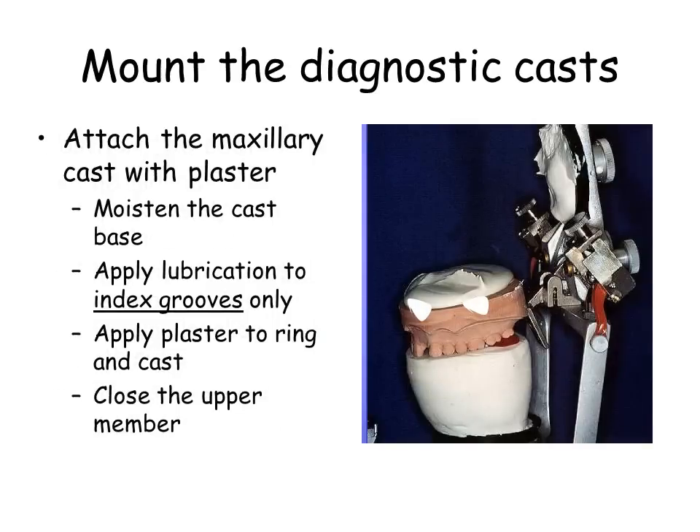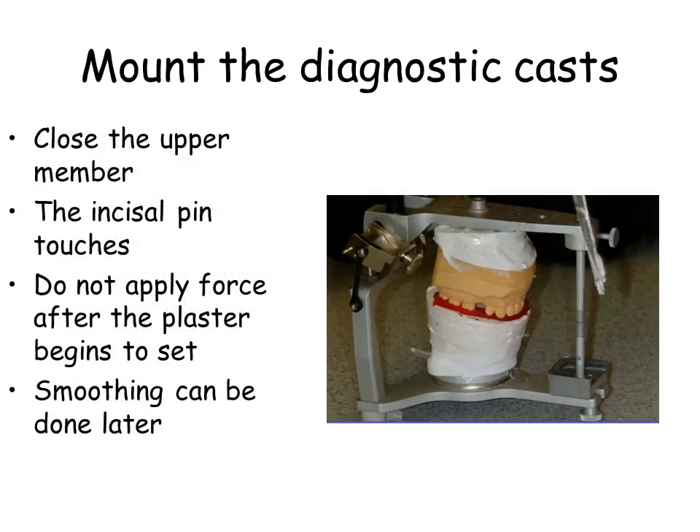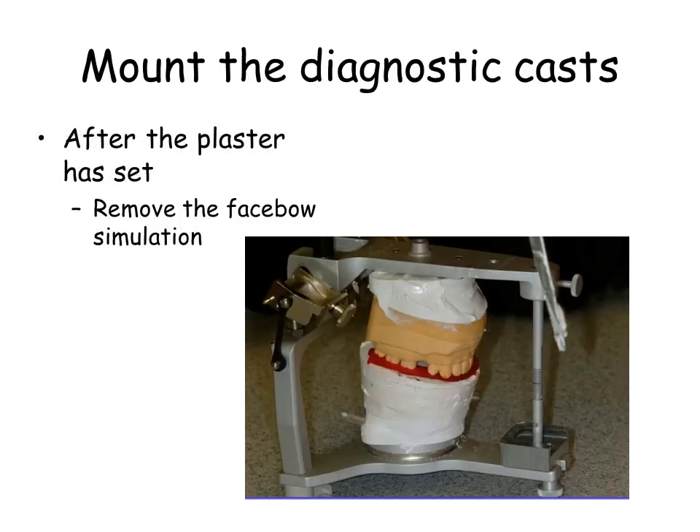Apply plaster to ring and cast. Close the upper member. The incisal pin touches. Do not apply force after the plaster begins to set. Smoothing can be done later. After the plaster has set, remove the facebow simulation and invert the articulator. Hold the mandibular cast in place with a variety of methods — your choice.